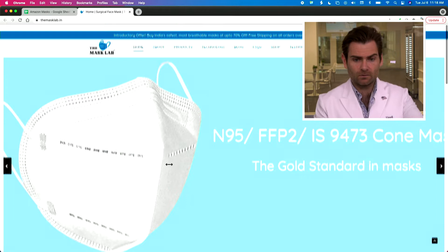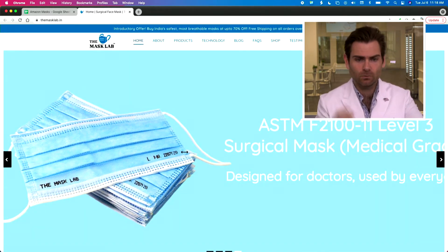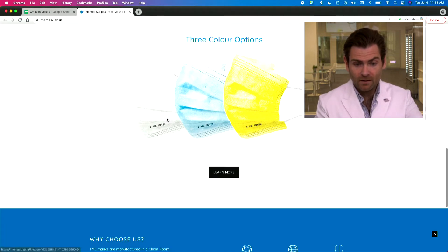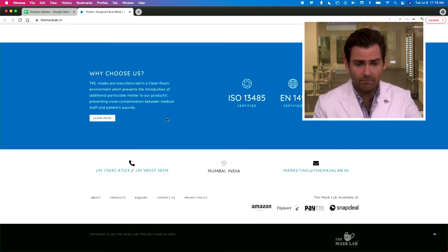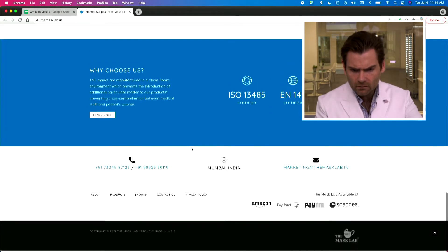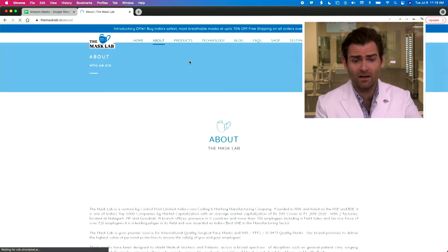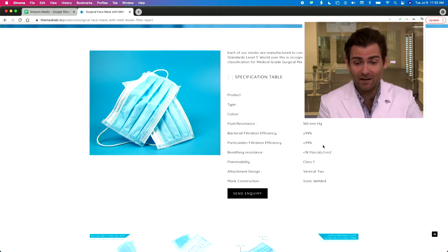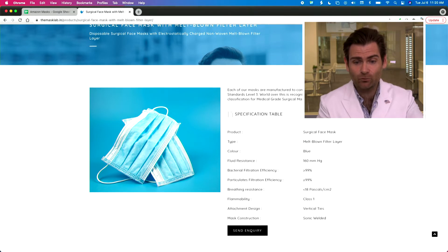Let's take a look at their website — masklab.in, because we're looking at the India masks today. They've got a lot of great stuff; started up at the top of the pandemic. Masks are manufactured in a clean room environment, which prevents the introduction of additional particulate matter into their products. Made in Mumbai, certified ISO — all that stuff. You can buy these on Amazon. They're claiming 99% particulate filtration, which is exactly what this machine is meant to test.